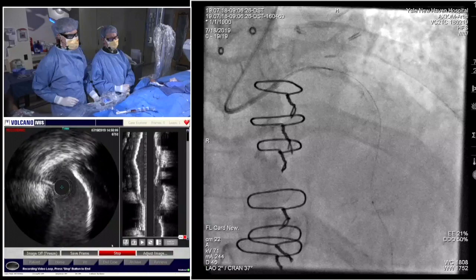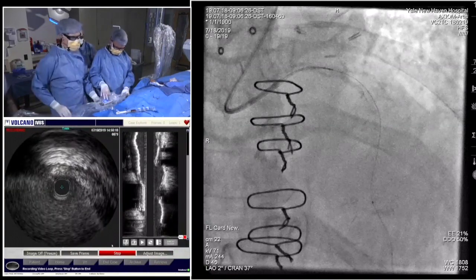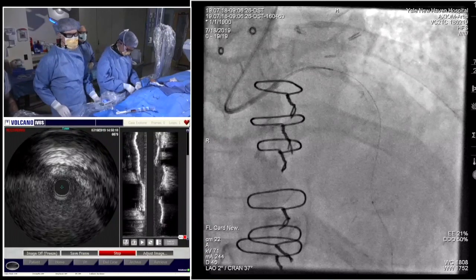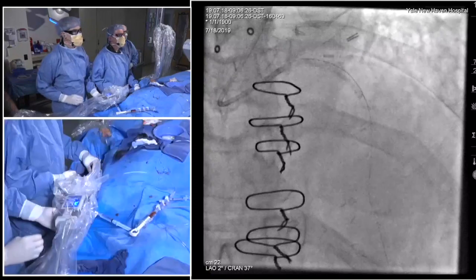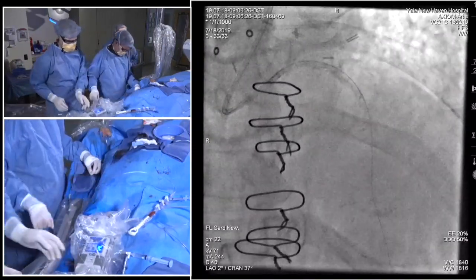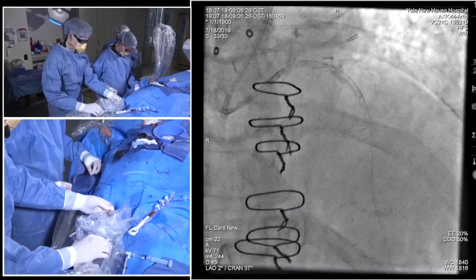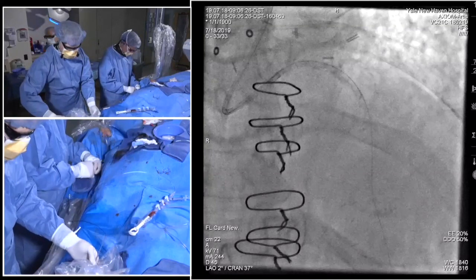So eccentric plaque in the left main, coming out to the ostium there. But overall, it looks like most of it's in the LAD. That IVUS does highlight the importance of imaging all these left mains. It's critical, as Jason was saying before, to image all these lesions before you intervene on them to understand exactly what you're dealing with, and size is so important.